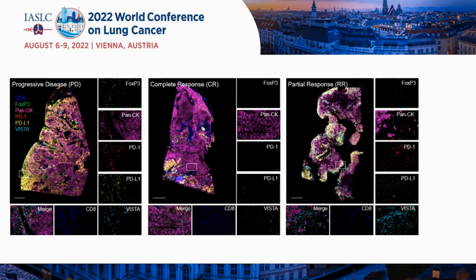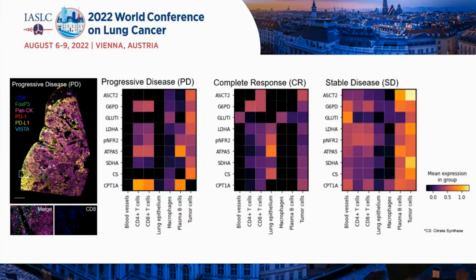But what we saw in the study, in a cohort of patients that were given immunotherapy, where we had their clinical endpoints and response to therapy data, was increased expression of metabolic markers, specifically in the tumor compartments of those patients that did really poorly. So what you're seeing here is increased presence of glucose uptake, specifically in the tumor regions of the patients that did really poorly.